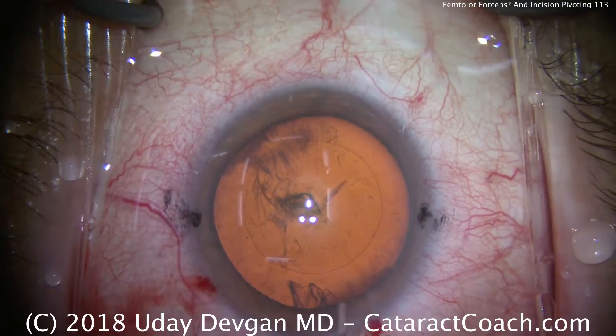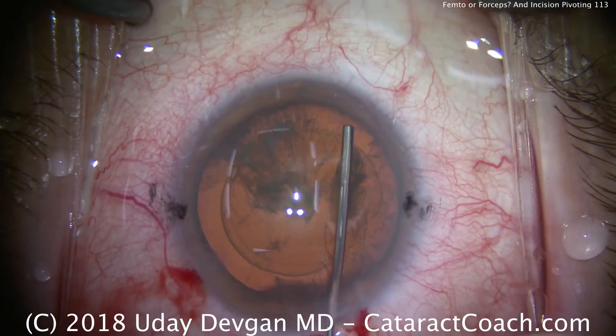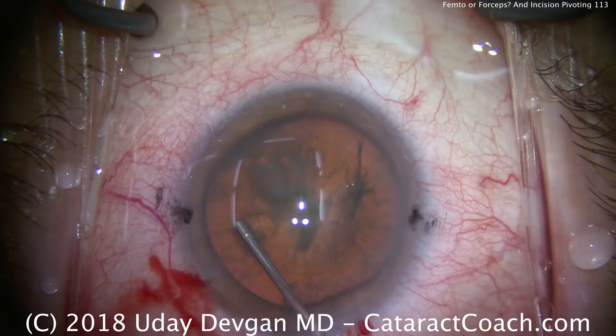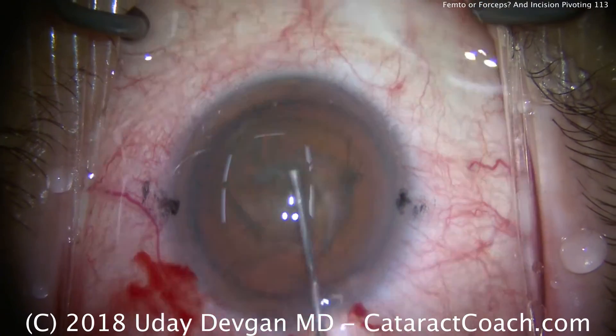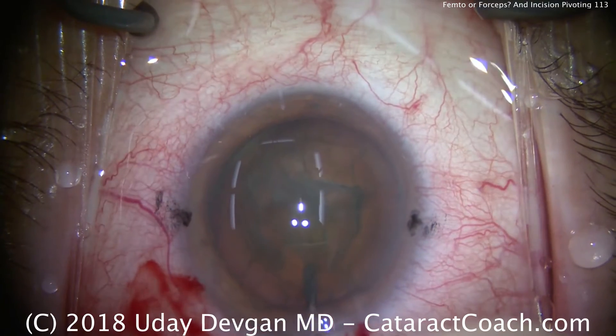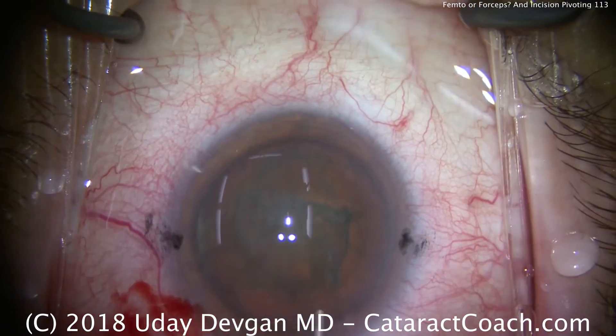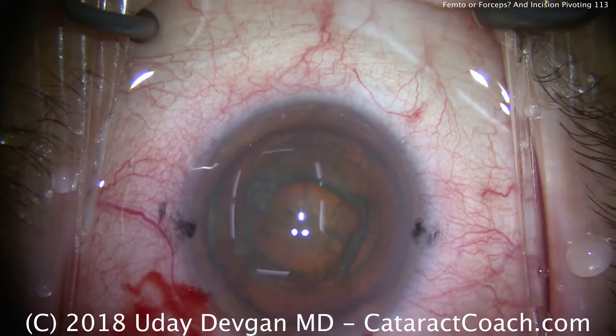Now the same pivoting idea applies here with the balanced salt solution on the blunt cannula for the hydrodissection. Notice how it goes just under the rhexis edge and fluid waves go across. We're expecting to lose some viscoelastic because we put BSS fluid in the eye, so we add a little more dab of viscoelastic.